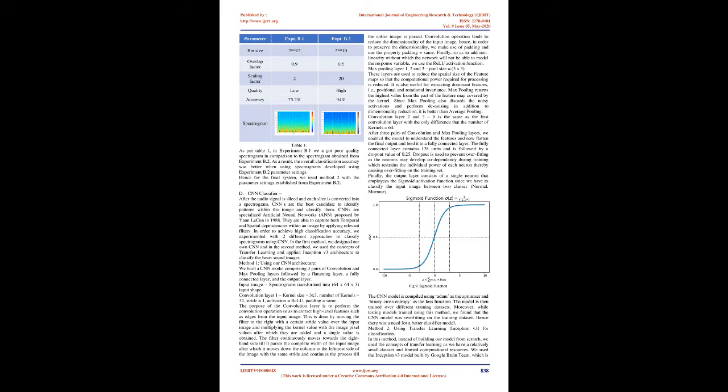In our case, since the audio signal is a continuous time signal, to transform it, the function is multiplied by a window function which is a non-zero value over a short period of time. Then the Fourier transform of the signal is computed with the window being moved along the time axis, resulting in a two-dimensional representation of the signal. Mathematically, it is expressed as where W(t) is the window function, Hanning window, centered around 0, and x(t) is our audio signal which is to be transformed.